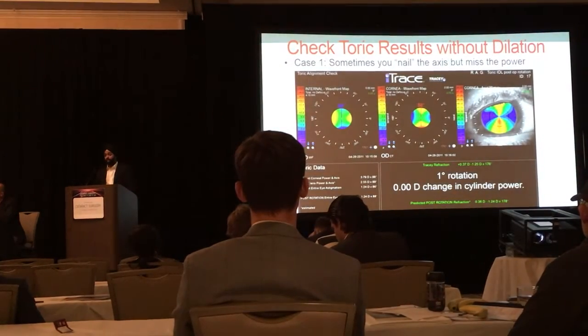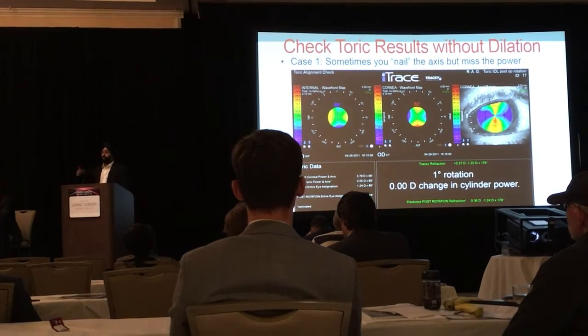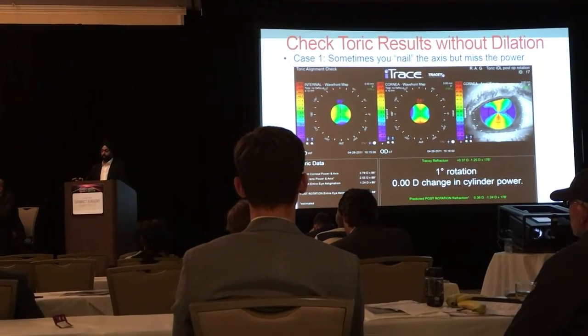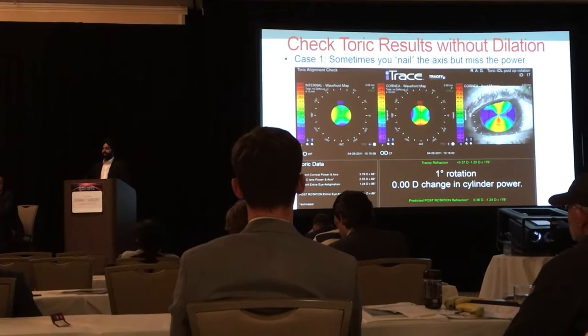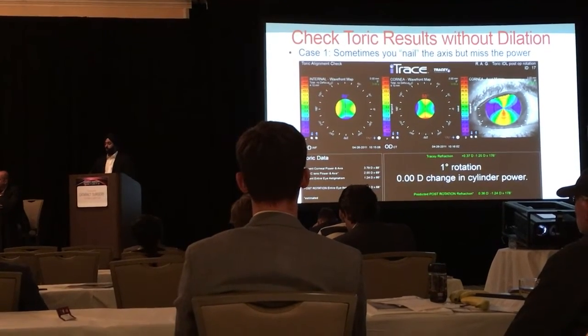But to me, what I love, and I think it's just kind of saved me in some cases, and I'm going to share with you a few cases, is what happens if you have that patient in the room who is upset at you, and you're like, oh man, what do I do? I don't want to dilate the patient and have to sit there and find out where the IOL is. I can actually do a 30-second scan, find out without dilating the patient, am I on axis, how is the power, and what do I have to do next?